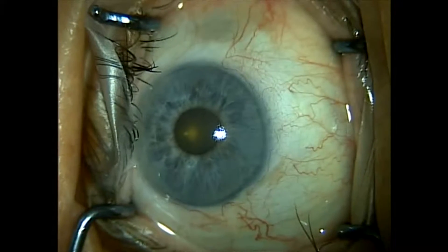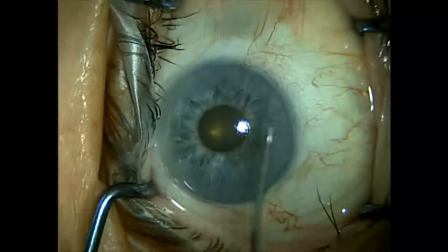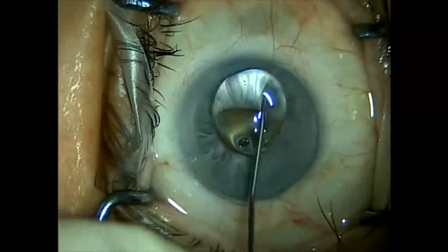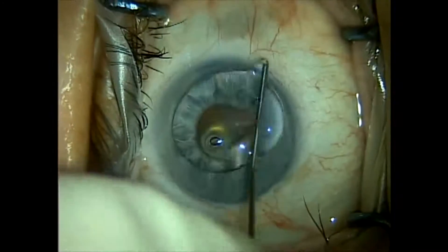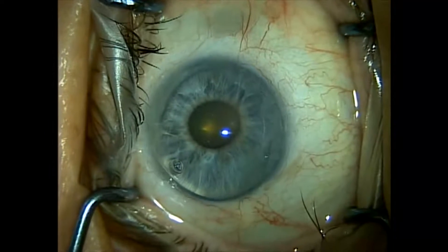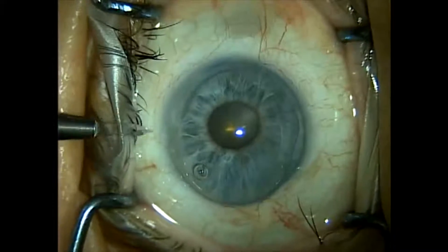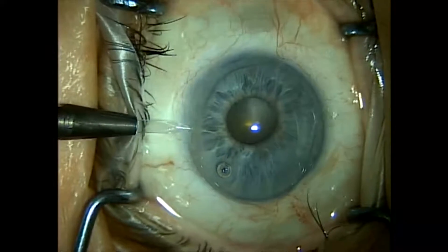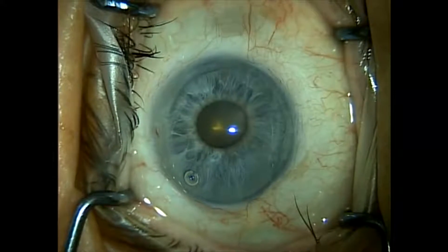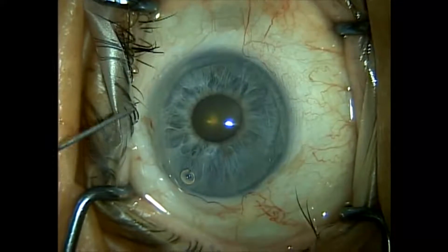This case represents how we do cataract surgery in the presence of a small pupil with the Malyugin ring made by MST Microsurgical. The patient obviously has a small pupil and is on Flomax-type agents, which will also create a floppy iris picture. The case is started with topical anesthetic only with 10 milligrams of Valium for oral sedation.